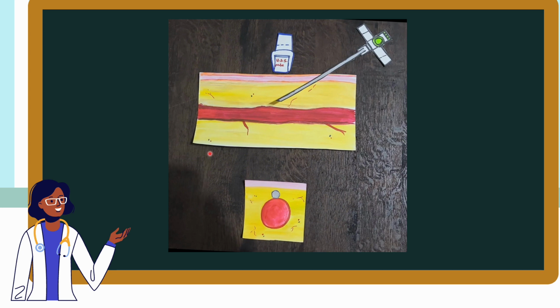Then how would you know if this is actually the tip? Beyond the tip of the needle there is nothing, hence you will lose the image. The point at which the image is lost can be assumed to be the tip of the needle. The ultrasound probe is then advanced in minuscule increments to lose the image of the needle tip. The tip of the needle again is advanced until it is seen on the ultrasound screen, and these two steps are repeated until the vessel is cannulated.